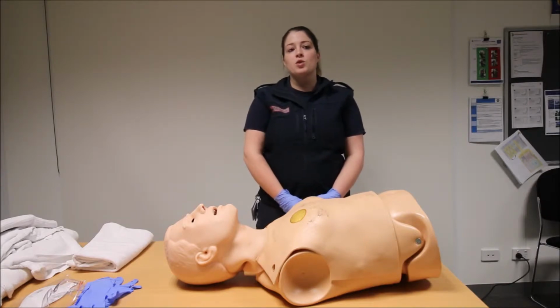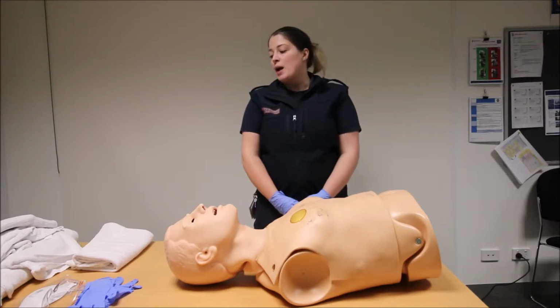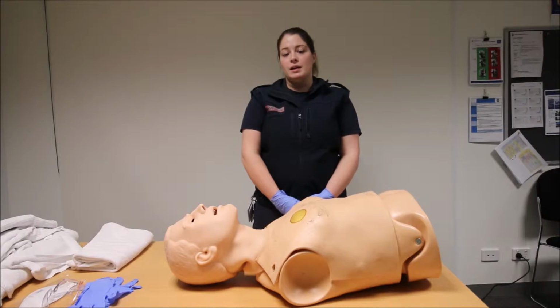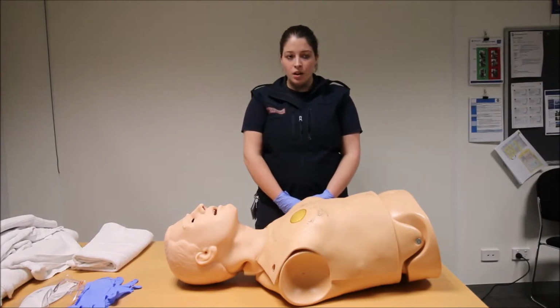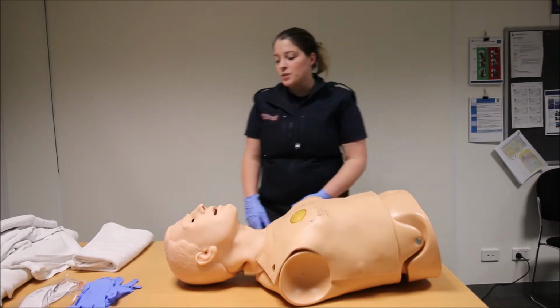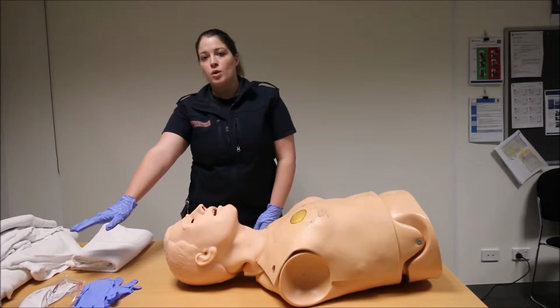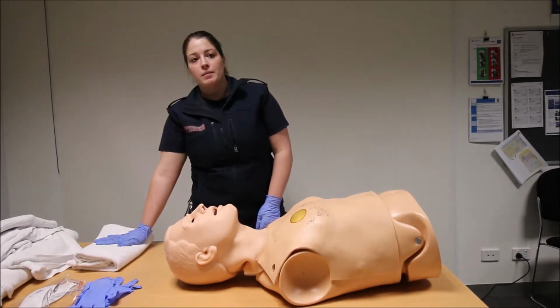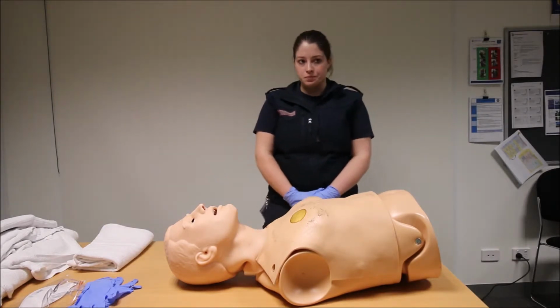Some considerations or modifications would include the patient that is spinally immobilised, and that the amount of padding and the position of the padding will vary depending on the position we've chosen and the size and the age of our patient. As with any approach to any patient, we have our personal protective equipment. Depending on what is wrong with the patient may vary what equipment we use, and then our padding. Depending, we can use towels, blankets or pillows, whatever's available.